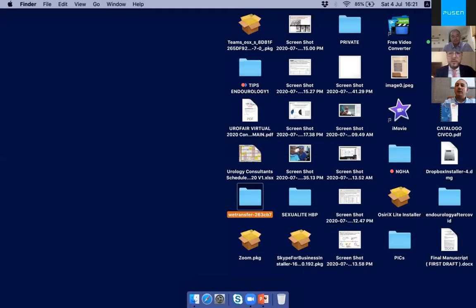Mehdi, you see the poll results here. As a beginner starting flexible ureteroscopy, this is a very nice poll, because I believe that with the scope, even in my hands, it was maybe 10 to 15 times. But those people, 20%, are using the scope more than 30 times. They must have a good experience or a big team. So what is the number of cases before you need a repair of your reusable scope in Tunisia when you started as a beginner?